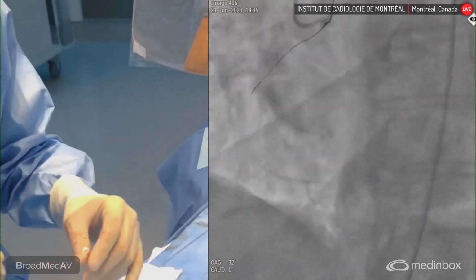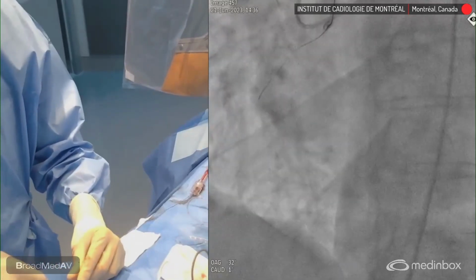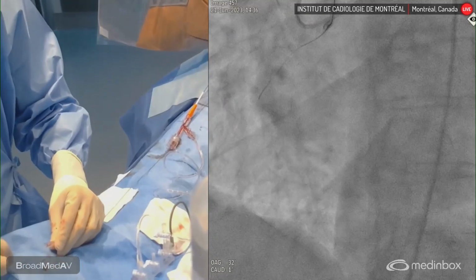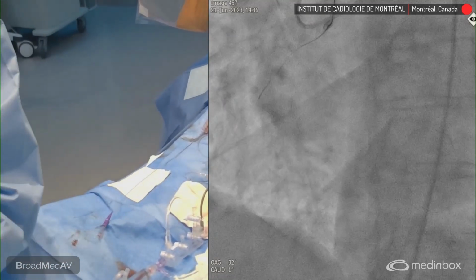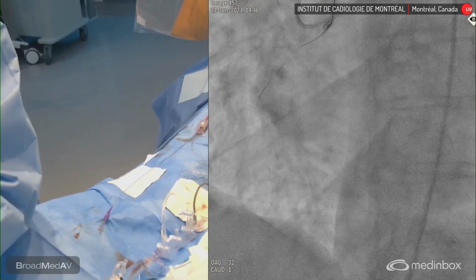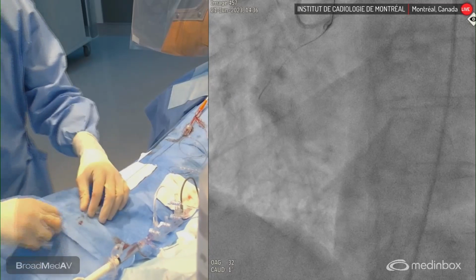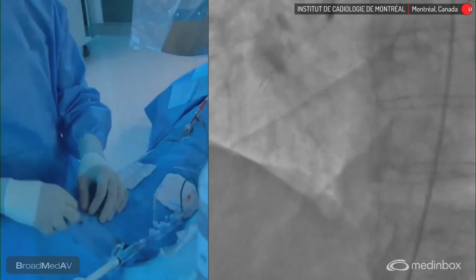You think about it as a Pilot 200 upgrade. Actually, I do most of my CTOs with the Gladius and with a success rate of about 70%, I would say. And since it's polymer jacketed also, it very rarely perforates, stays in the vessel architecture.